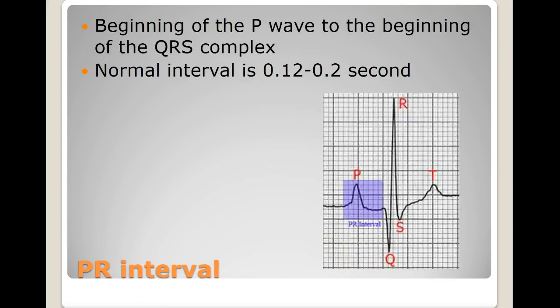Now let's look at the PR interval. The PR interval encompasses the contraction of the atrium and goes all the way to the beginning of ventricular depolarization. The beginning of the P wave to the beginning of the QRS — highlighted here in purple — is the PR interval, and it should be 0.12 to 0.20 seconds.